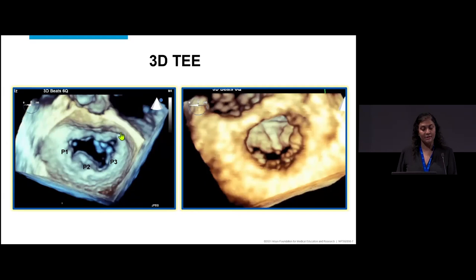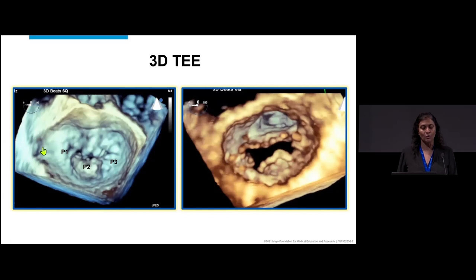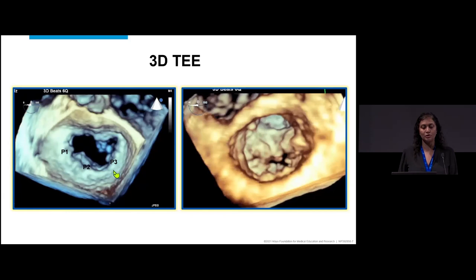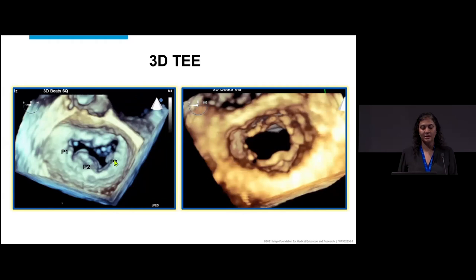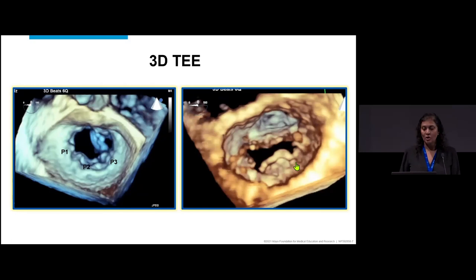On 3D imaging, the surgeon's view — we're standing in the left atrium looking down on the mitral valve. Aorta is up at the top, left atrial appendage is lateral, and here is medial and posterior. The scallops of the posterior leaflet are labeled P1, P2, P3. We can see the P2 scallop is prolapsing quite a bit, and there are some small torn cords as well.